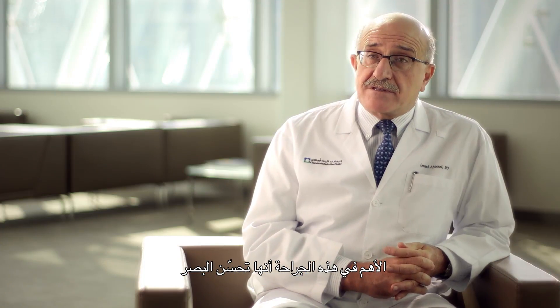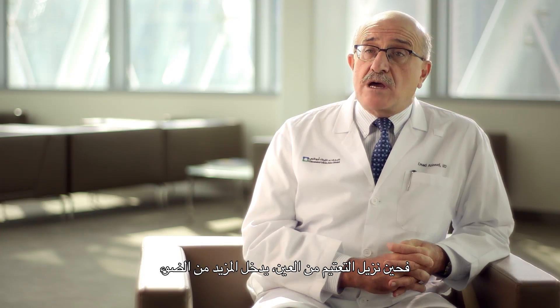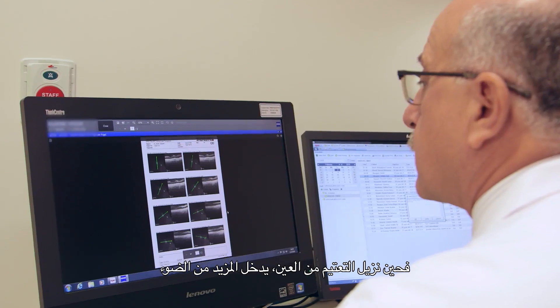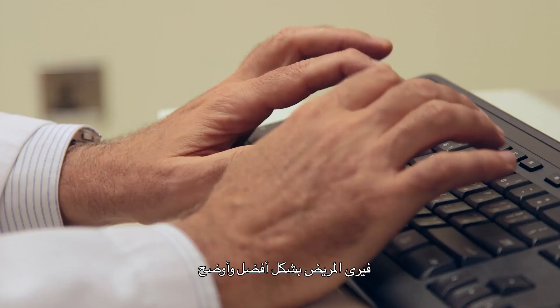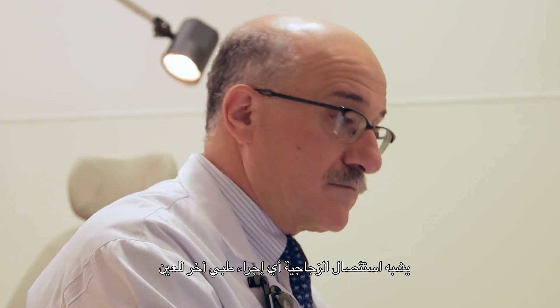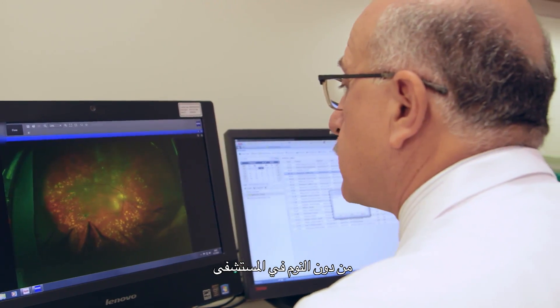The most important benefit from this surgery is visual improvement. As we remove the opacity from the eye, it allows light to get in and the patient sees better or clearer. Vitrectomy, like most eye procedures, is performed on an outpatient basis.